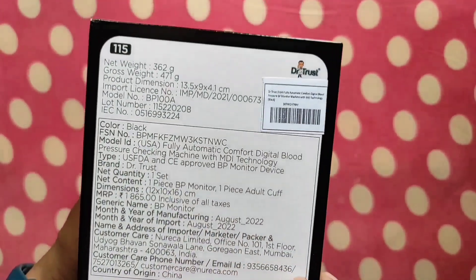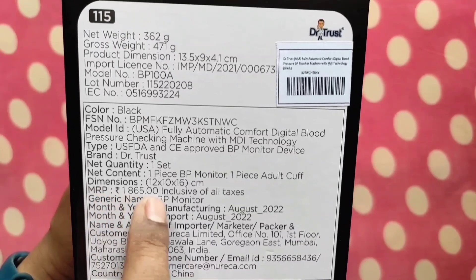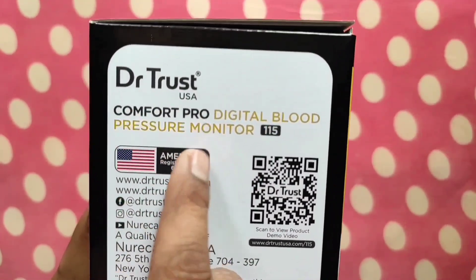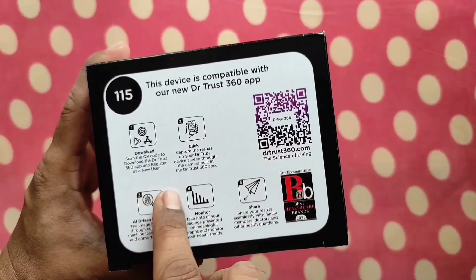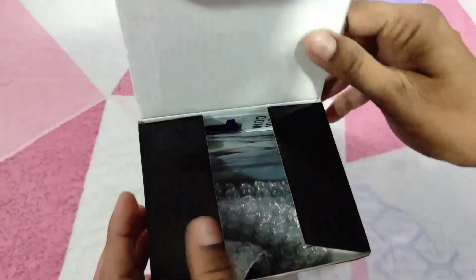About the price: it is listed at 1865 rupees, but I got this product from Amazon at only 1600 rupees. This Dr.Trust BP Monitor 115 is compatible with the new Dr.Trust 360 app, which is available in the Google Play Store. I will tell you the significance of the app in the later part of the video.